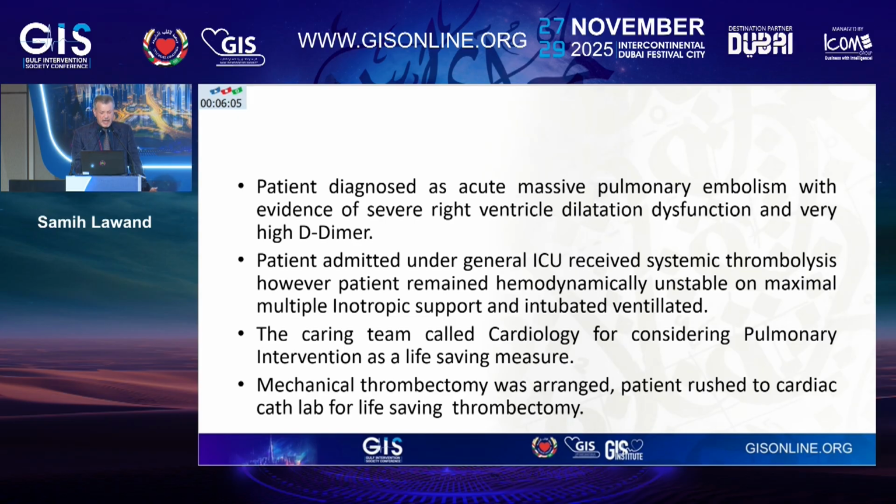This was around 1 a.m. In the morning, shortly after that, when they realized the patient was not getting any better, they called us to see what we could do and consider a life-saving intervention. At that time, we arranged for mechanical thrombectomy. Actually, the patient was planned to go to the radiology department.